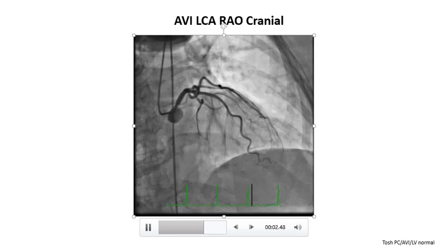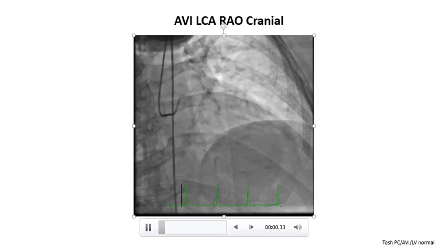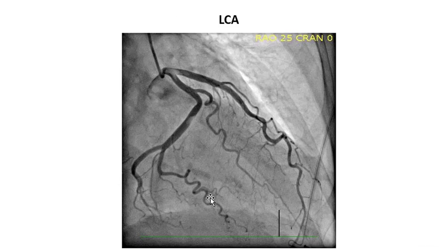The third of that shot I showed you of the little wire cage. We'll move on. This is a close-up still, shows you the catheter at the root of the coronary artery injecting the left coronary artery, and you can see fine branches. There's little differences in opacity, they're artifact. That opacity depends on the thickness or the density of the dye coursing through the vessels, and it can vary. This shot is taken near the end of the run, so we're starting to lose dye.